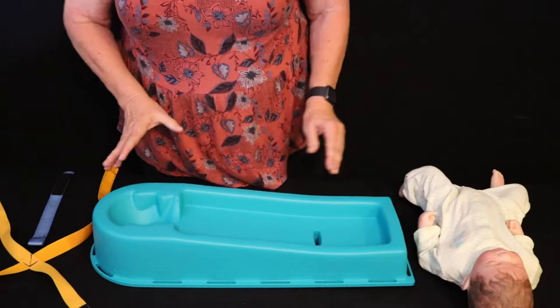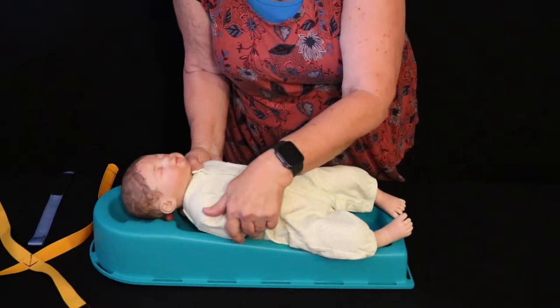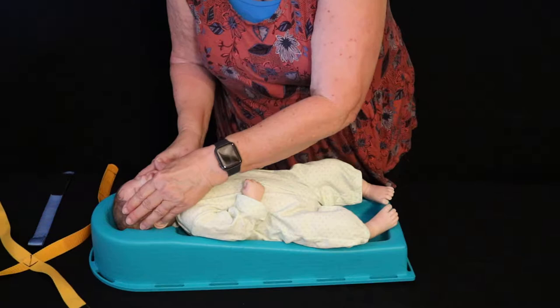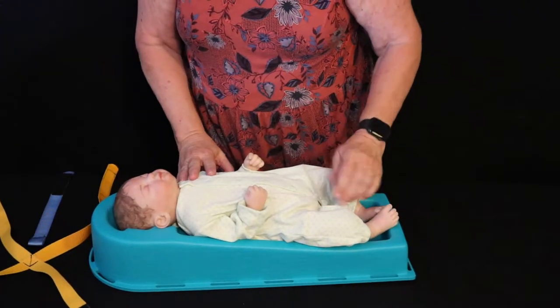When placing the baby in any cradle, you want to make sure that you're getting the baby into a nice head tilt as you're placing the baby in. You want to actually do a bit of a tip down to open the airway, and of course you're going to listen and make sure that it's in place.